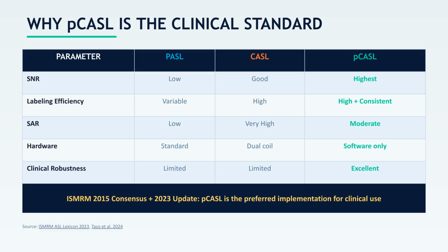pCASL is the clinical standard due to its highest SNR, high and consistent labeling efficiency, and moderate specific absorption rate, or SAR. It is software only and demonstrates excellent clinical robustness. It is the preferred implementation for clinical use.